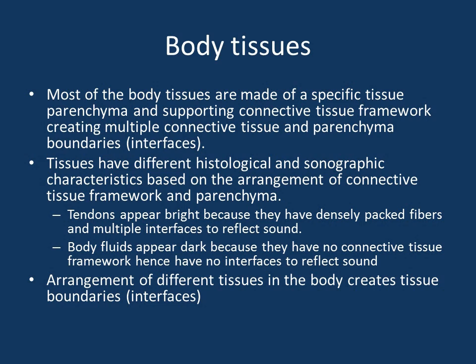Tendons appear bright because they have densely packed fibers and multiple interfaces to reflect sound. On the other hand, the body fluids appear dark because they have no connective tissue framework, hence have no interfaces to reflect sound. The arrangement of different tissues in the body creates tissue interfaces.